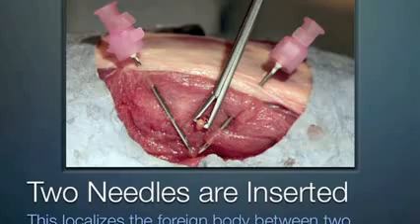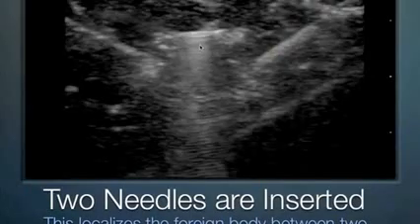We took one needle here coming across, another needle coming here, and this is the actual grasper here with this reverberation artifact grabbing the wooden toothpick. So these two needles can localize the location at which to put the grasper.